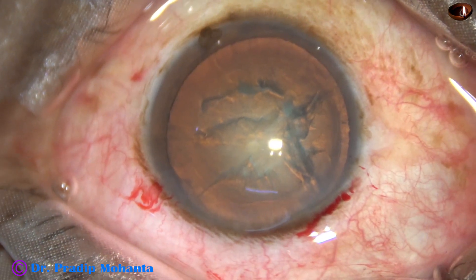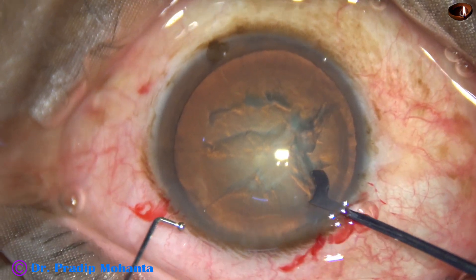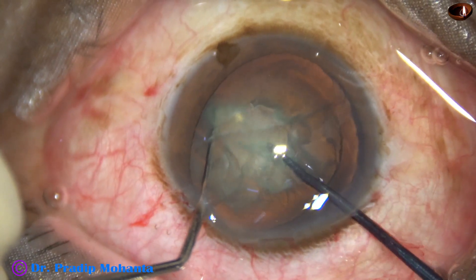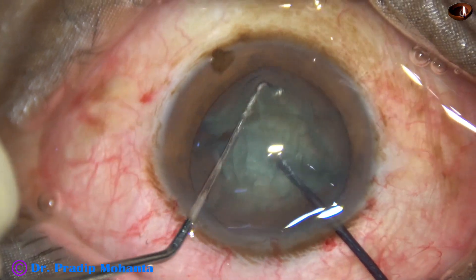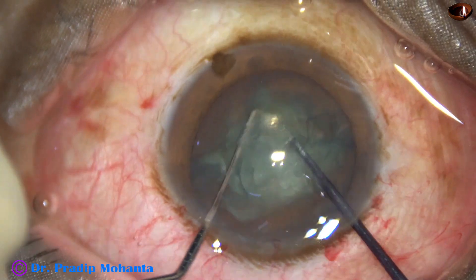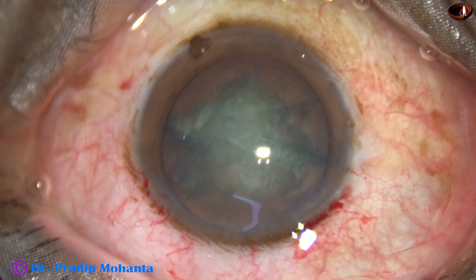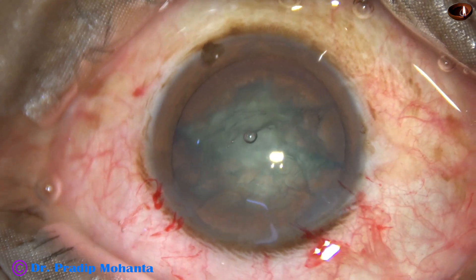Now I am using a pre-chopper in this case, designed by Dr. Suhail Irfan Khan from Nanded, Maharashtra, India. The nucleus is nicely divided into 2 halves. An attempt was made to divide one hemi-nucleus further, but it did not work. Anyway, we have 2 hemi nuclei.